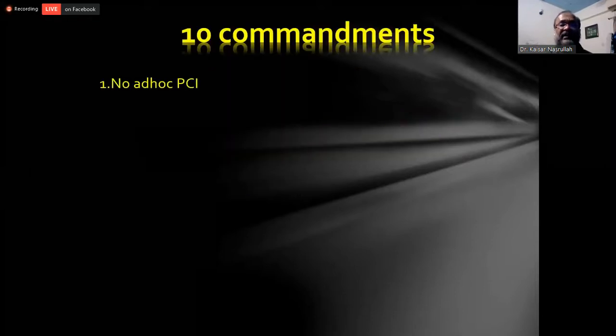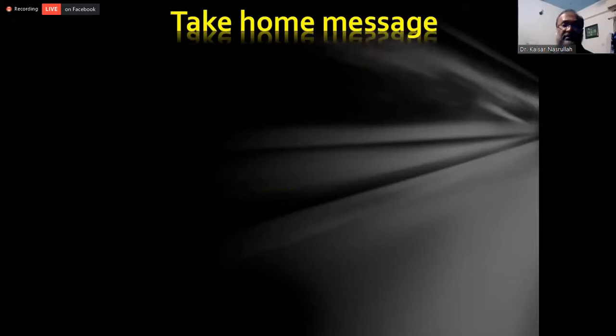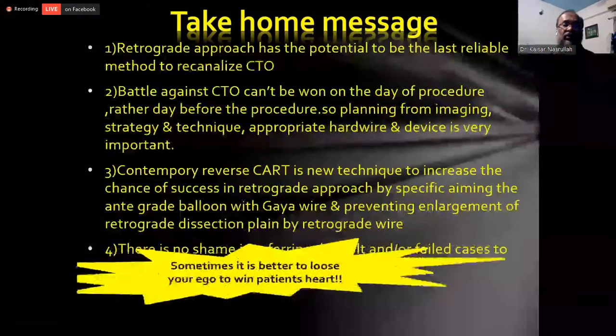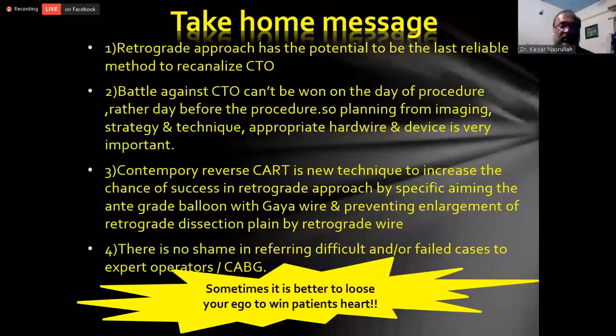So my take-home message is: there are 10 commandments. No ad hoc PCI, dual injection, study the angiogram, make a plan, check ACT every 30 minutes, support, ECG and pressure monitoring, minimize radiation, and vigilance for complications and persistence. Sometimes if you can't do it, refer to an expert operator or CABG.